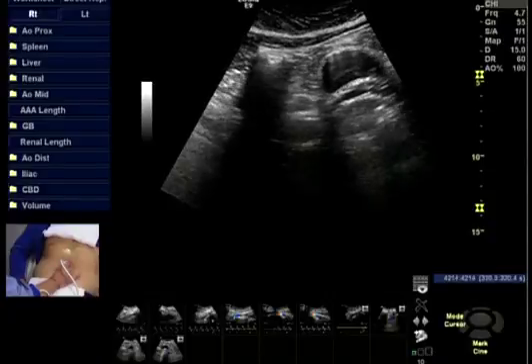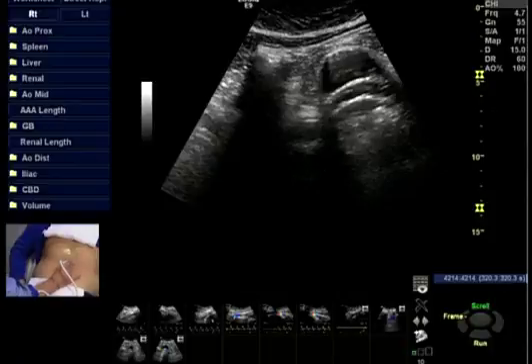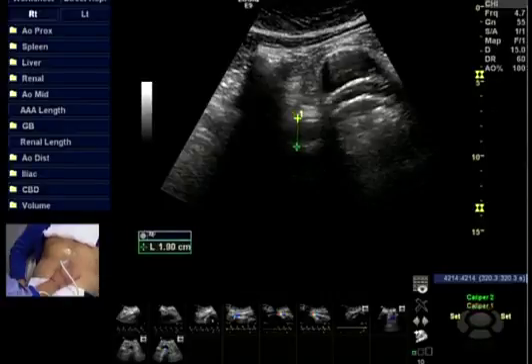Other thing we notice is very proximal in the aorta, just below that area of the gas bubble. I'm going to go ahead and freeze the image since I get a reasonably clear view of that proximal aorta. And while I have that particular image in view and no gas overlying it, I'm going to go ahead and take a proximal aortic measurement right at the attachment site and go ahead and acquire that documentation and store it in system memory. So I have that bit accomplished at this point.